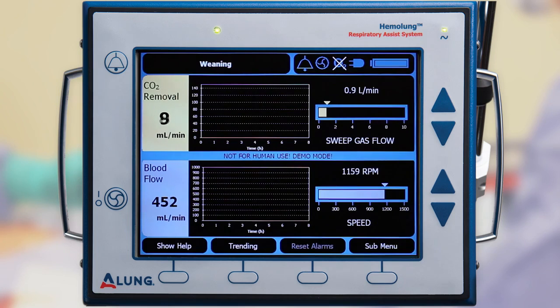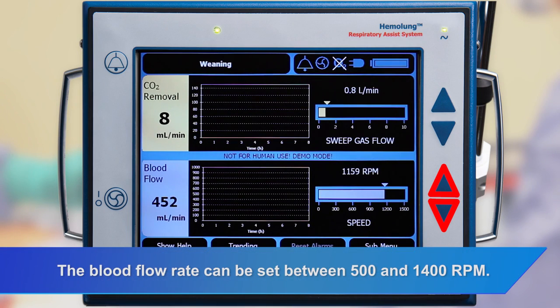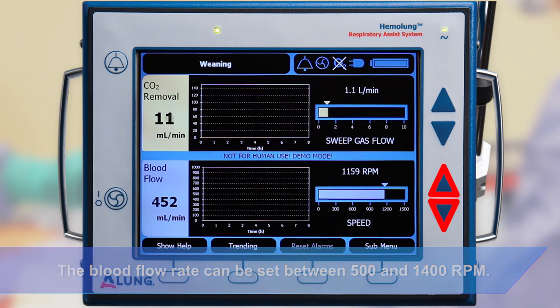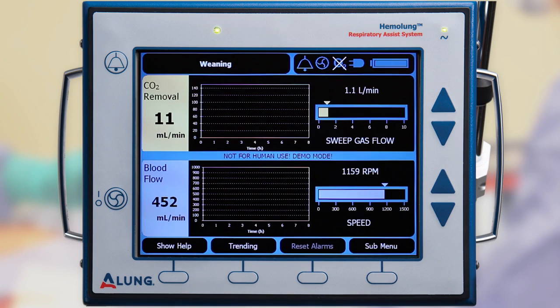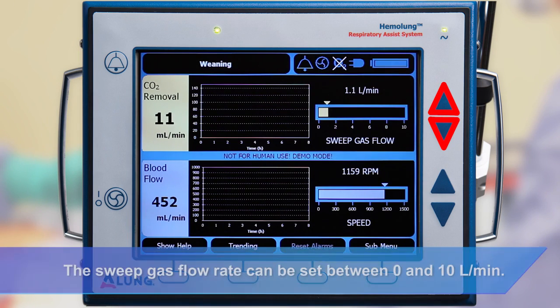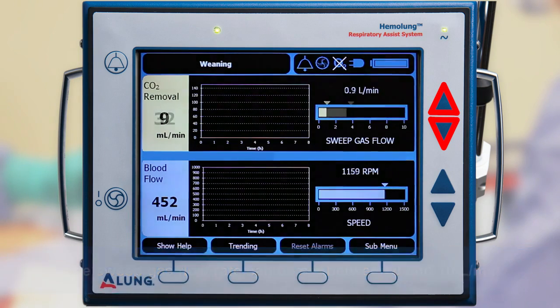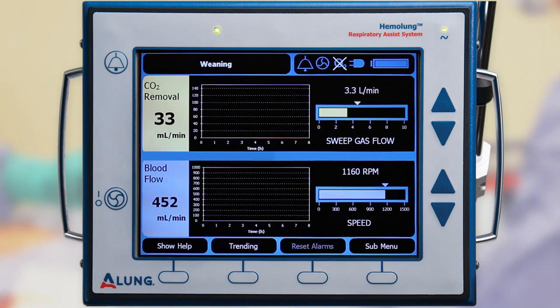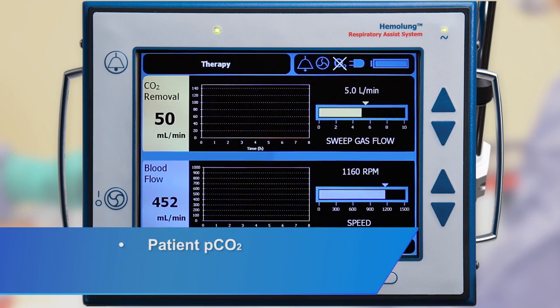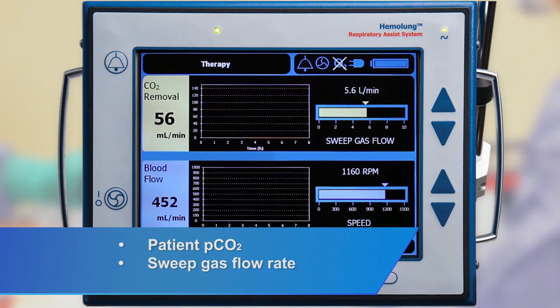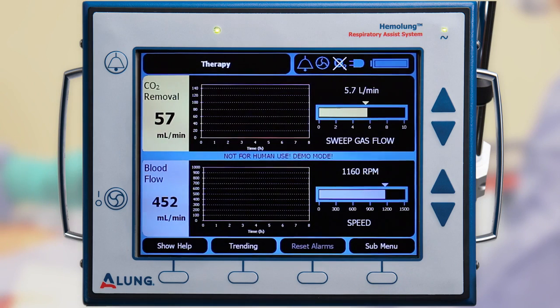To adjust the blood flow rate, use the lower set of arrow keys. To adjust the sweep gas flow rate, use the upper set of arrow keys. CO2 removal is dependent on three fundamental factors: patient PCO2, sweep gas flow rate, and blood flow rate.